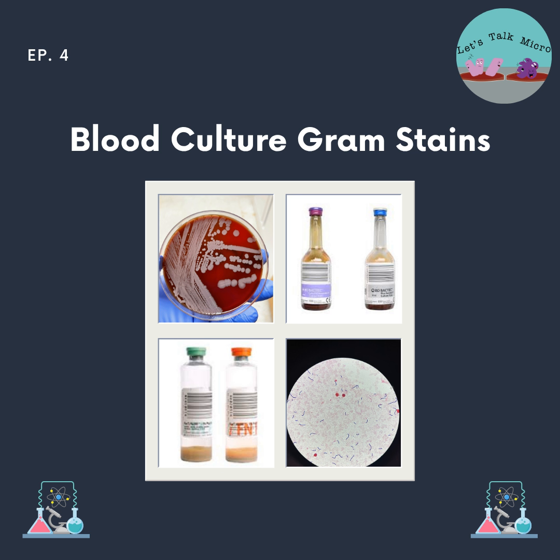We also went over some differences about what we report in blood culture gram stain slides versus regular slides. We do not quantitate for blood cultures. No 1 plus, no 2 plus, no 3 plus. And we do not report the PMNs. In addition, if it's an NOS or no organism seen, you do not report that either. You will document it internally.